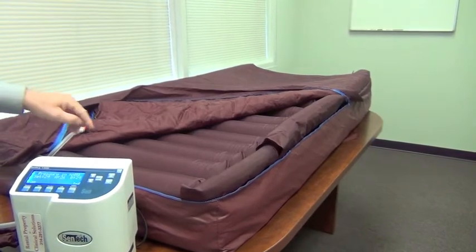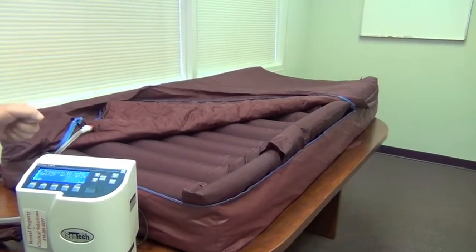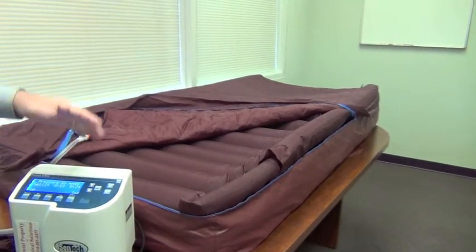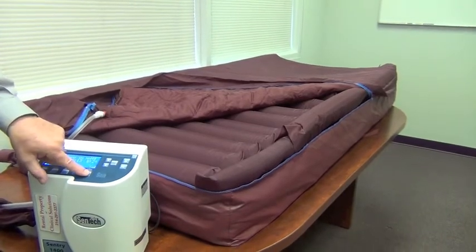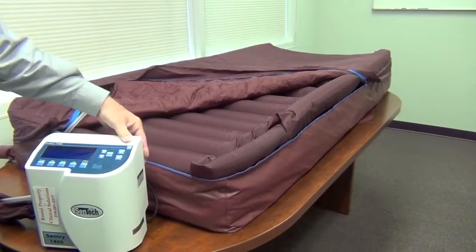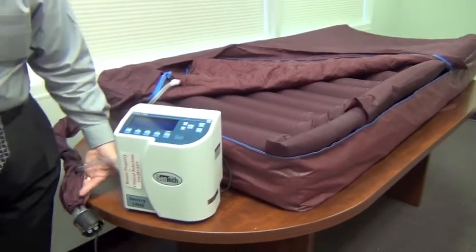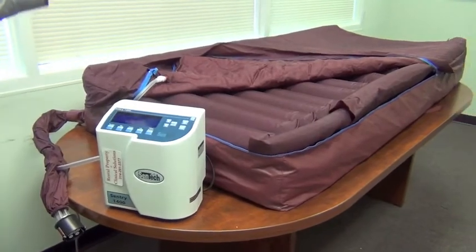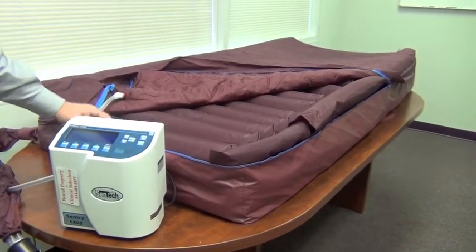If you're getting somebody in and out of this product, what I would strongly recommend for safety reasons is to let the patient know what your intent is, obviously. I would deflate the side bolsters, turn the unit off, disconnect the air supply here as though you were performing CPR, and now the patient's weight is going to bring them down very slowly to frame height on the bed.